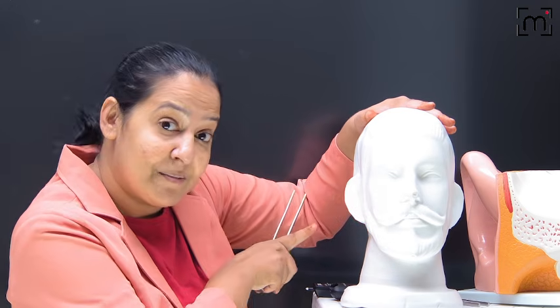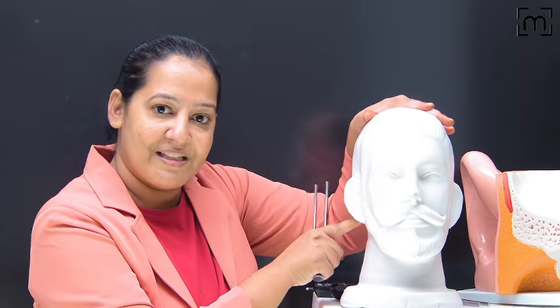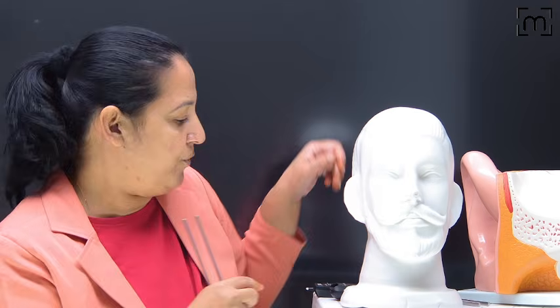So the patient is having some sensorineural deafness. Yes or no? So that's why the patient feels that it stopped, but it's still vibrating. I can feel it. So here it is activating the mastoid of my patient, and here it is activating the examiner's mastoid. I hope you are getting it.